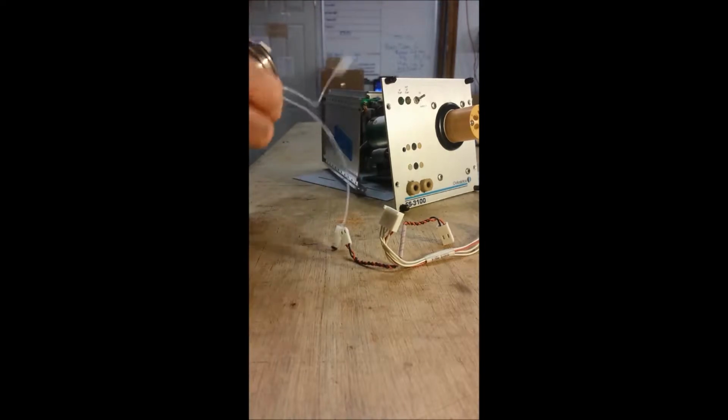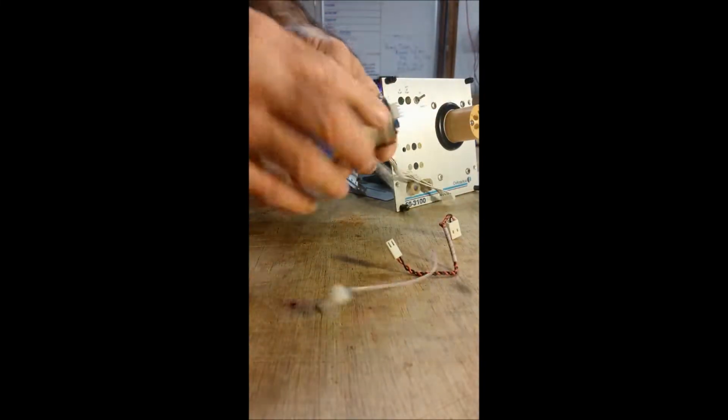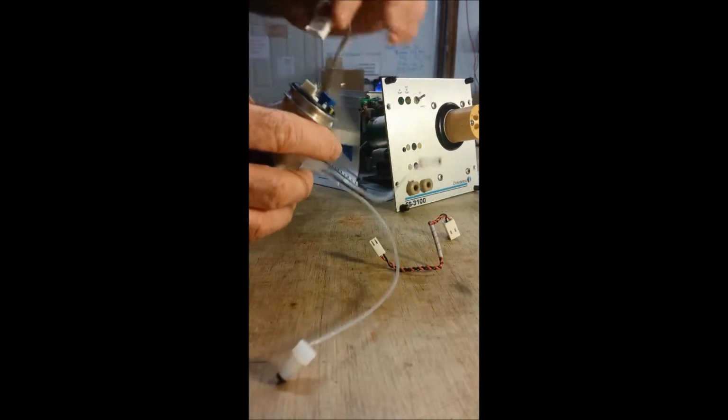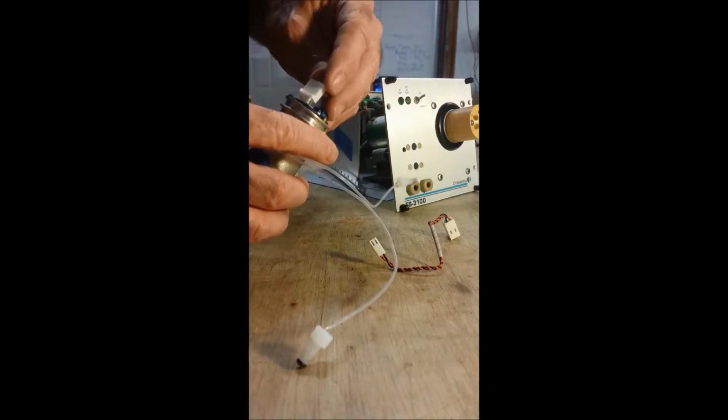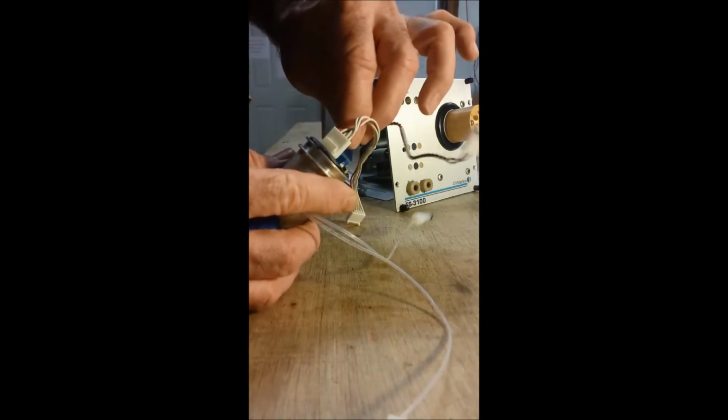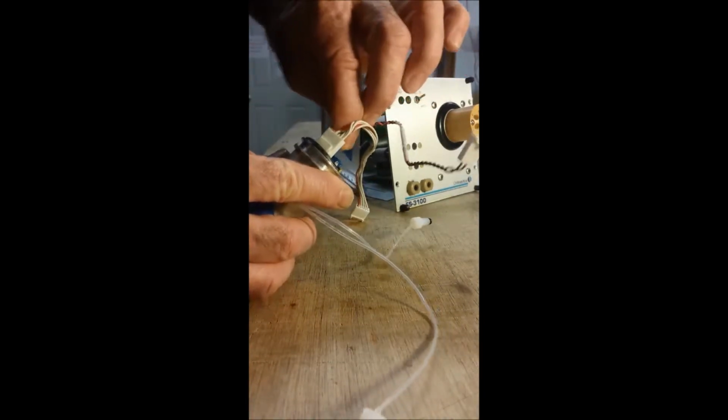FS3100 valve module, which has the heater in it. Normally, I haven't changed the tubing yet because I'm going to do a video on that, but for now, when you do change that, you always want to take off the cables because you don't want to damage these fittings during that process. So you put those back on.